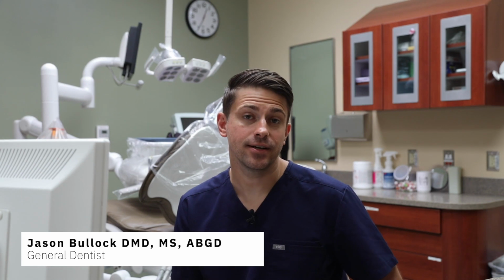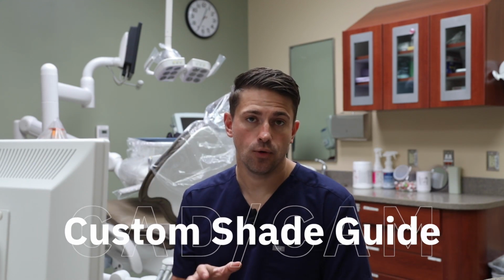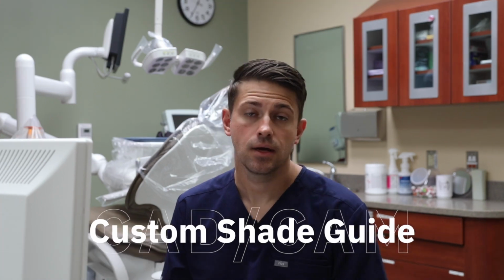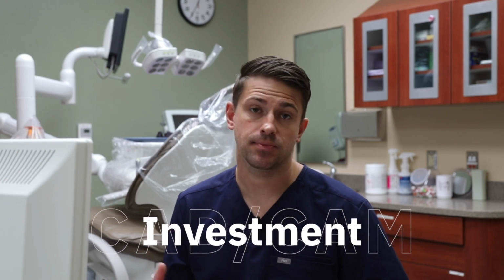Going on, guys? Dr. B here, and I wanted to take a moment to do a video about how I'm actually creating a custom shade guide for e.max restorations. Now, to do that, it will require a little bit of work on your end just to get it going. It will be a little bit of an investment as well, as far as having to buy some materials and have some things available to do this.